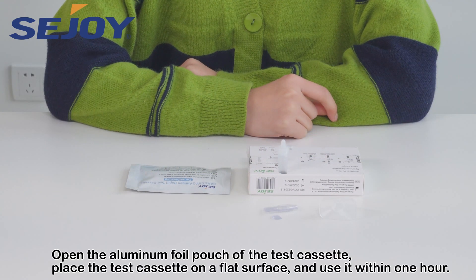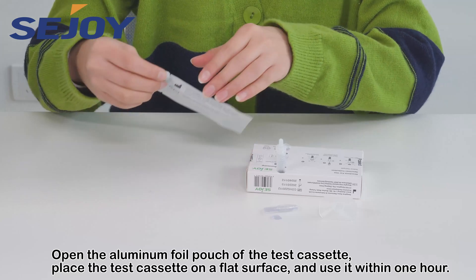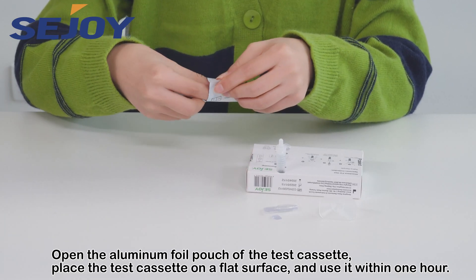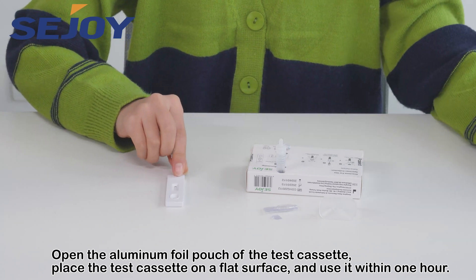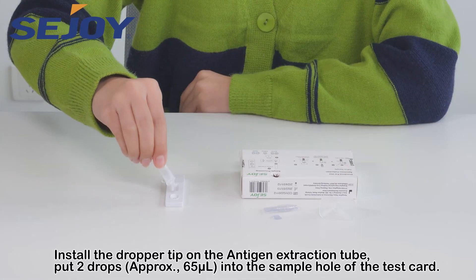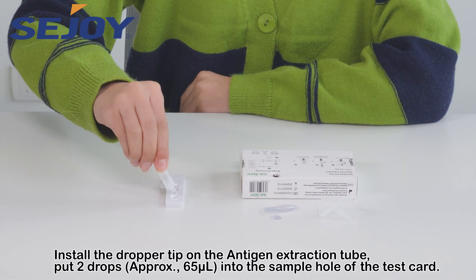Open the aluminum foil pouch of the test cassette. Place the test cassette on a flat surface and use it within one hour. Install the dropper tip on the antigen extraction tube.